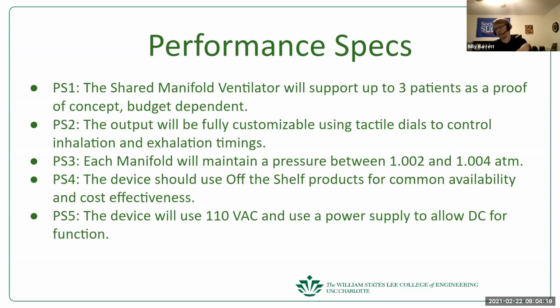Okay, that makes sense. I've never worked with oxygen regulators, but I guess that makes sense that they'd be adjustable. I think that's your only control loop per se, right? You're going to read the pressure and then manually adjust until you get it stabilized.